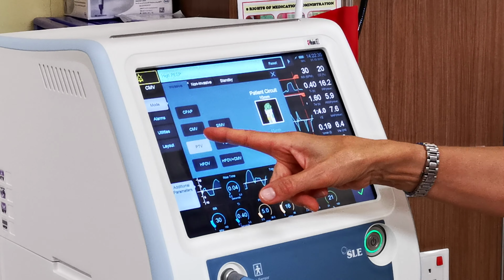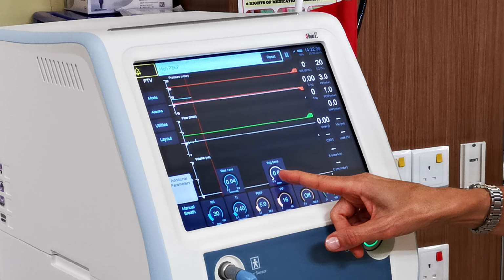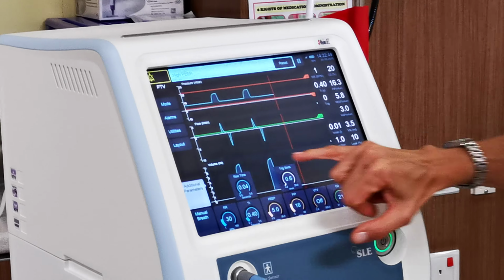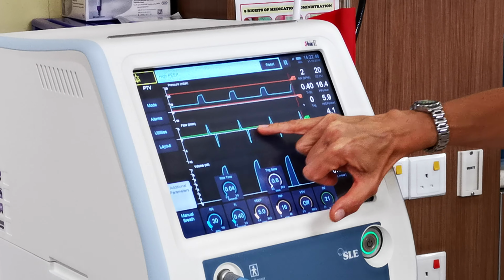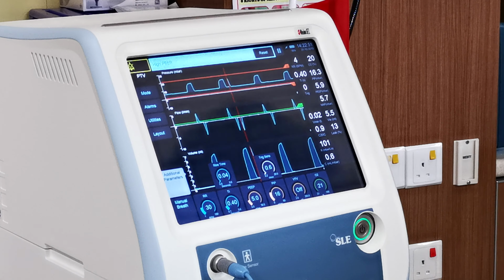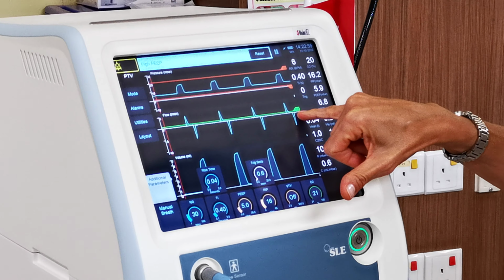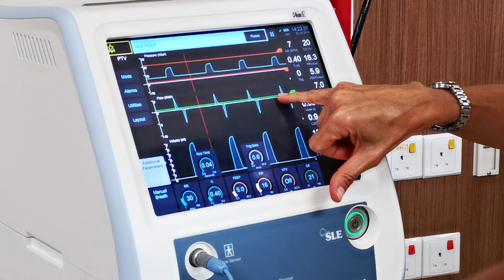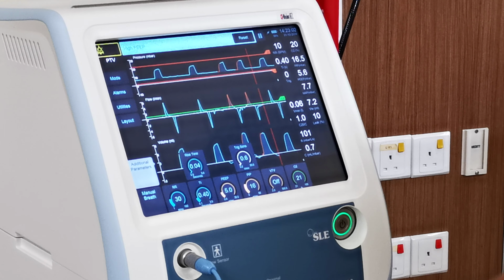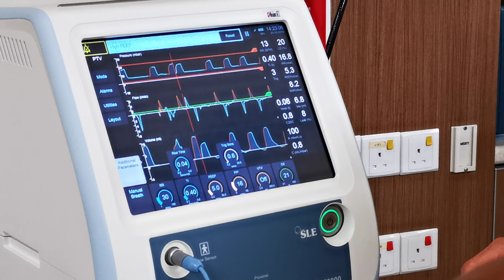Okay. So whenever you are in PTV, here, you will need to set a trigger for the ventilator to pick up the breath of the patient. Your trigger is here, a green line that you have on the ventilator. When the patient takes a breath, when he has some flow going to him, when the flow reaches 0.6, the green line, the ventilator knows that the patient took a breath. So you see here my patient took a breath and the ventilator is now synchronized with the patient.